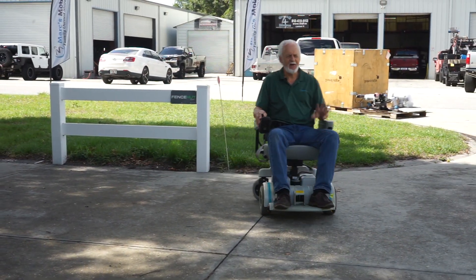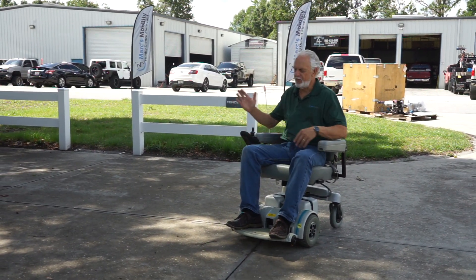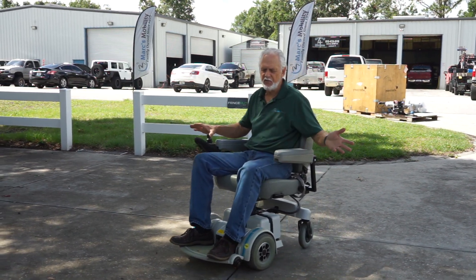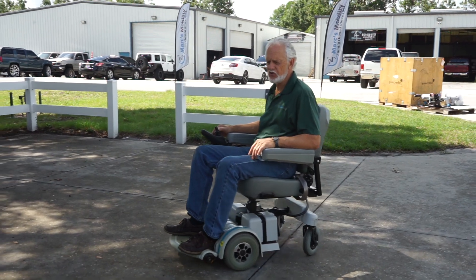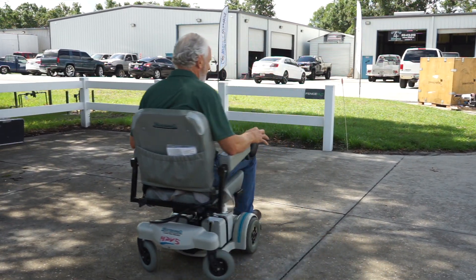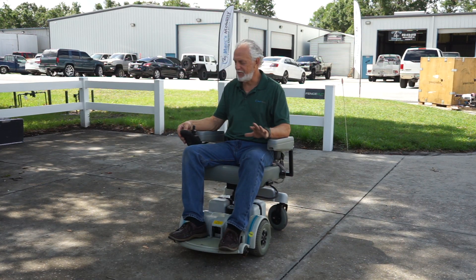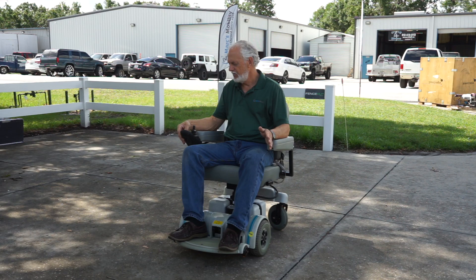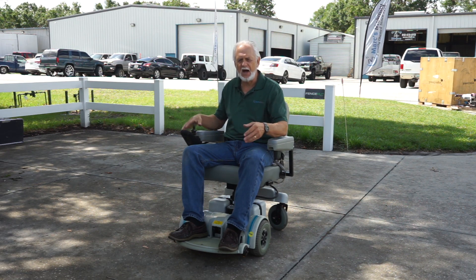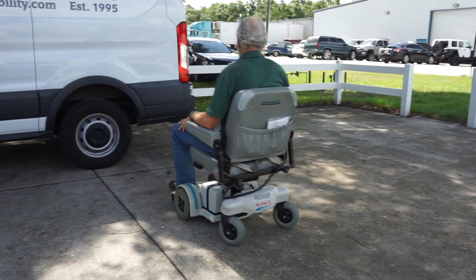This chair has five speeds. If I put it on the first speed — I just went from five down to one — this is the first speed. It turns at this speed but it's not very fast. I'll put it back to five: one, two, three, four, five. This chair picks up speed as you drive — if you hold the joystick forward it takes off as you start rolling.